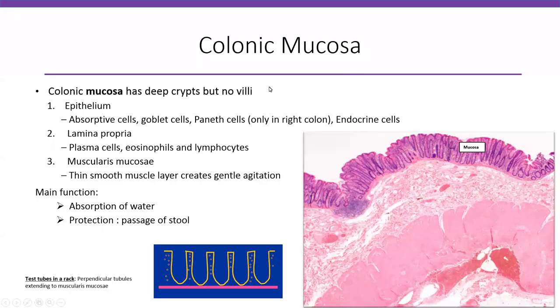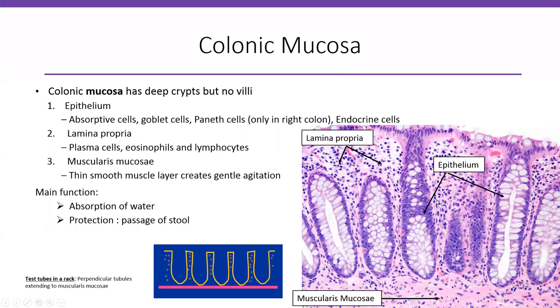Colonic mucosa is composed of deep crypts. Notice that there is no villous formation — the surface is very smooth. On higher power, the mucosa consists of epithelium lining the surface and going deep into the crypts. It looks like tubes in a rack, and in normal conditions they are equidistant from each other.